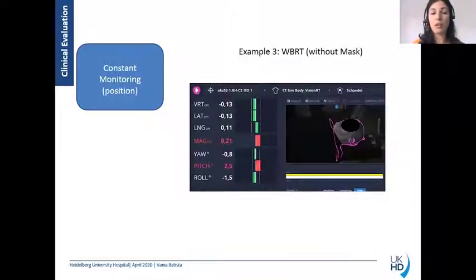That means that you can also correct pitch and roll, and because you have the video function, that is the biggest advantage compared with the last version. When you have something like an incorrect pitch, you can directly look at the view and see which direction you need to rotate the patient.